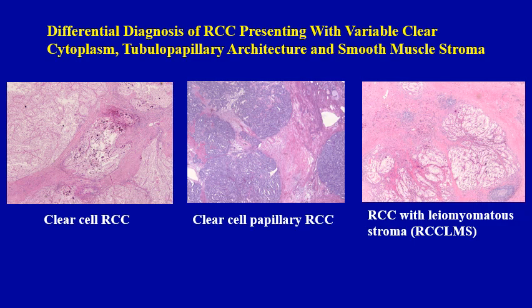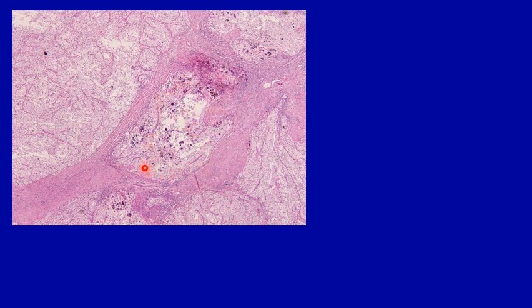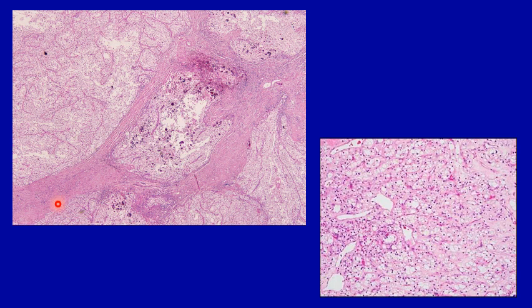Let's discuss morphology clues for the diagnosis. Morphology clue number one for clear cell tumors: when you see the presence of at least focally predominantly displayed acini with delicate, intricately branching vasculature — also referred to as racemose vasculature — within a tumor, it usually supports the diagnosis of clear cell renal cell carcinoma. You typically see this feature in low-grade areas, so extensive sampling is key to diagnosing clear cell RCC. Here is one such example showing a relatively clear-looking tumor with prominent nodules separated by smooth muscle stroma, but in well-differentiated areas the delicate intricately branching vasculature is identifiable.